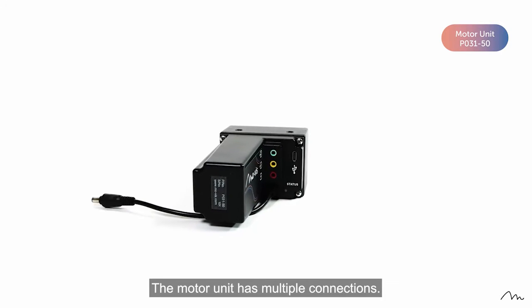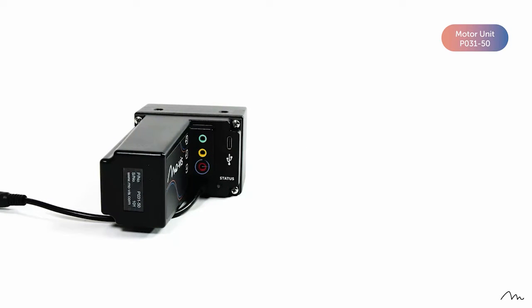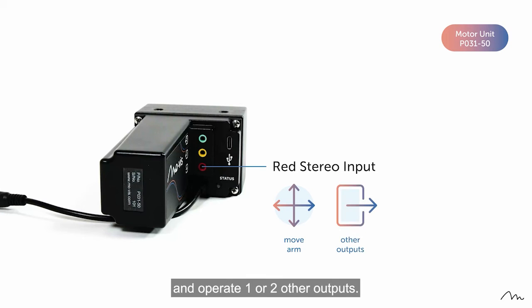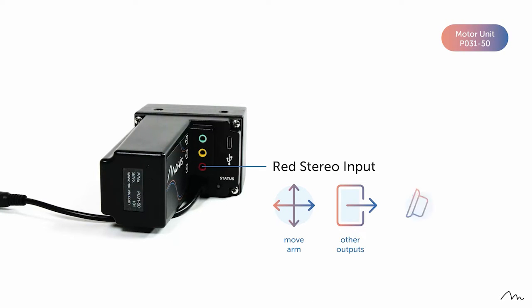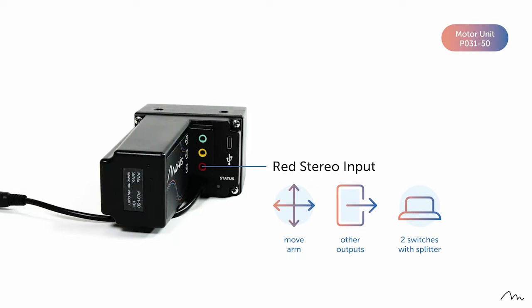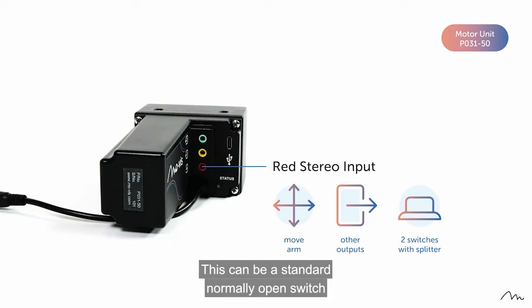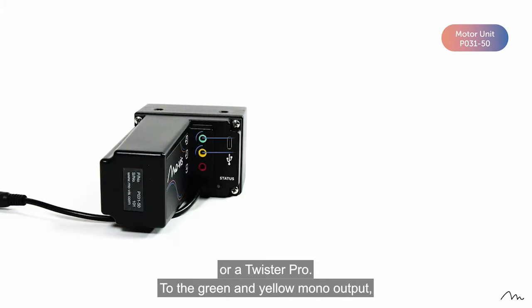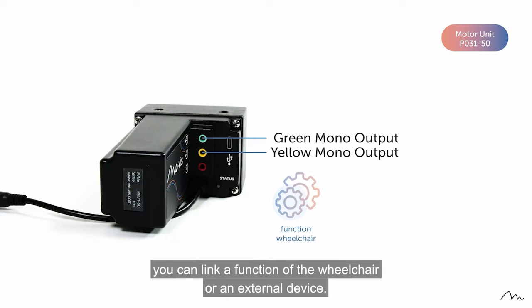The motor unit has multiple connections. With a red stereo input, you can move the arm and operate 1 or 2 other outputs. By using a splitter, you can also connect 2 switches. This can be a standard normally open switch or a Twister Pro. To the green and yellow mono output, you can link a function of the wheelchair or an external device.